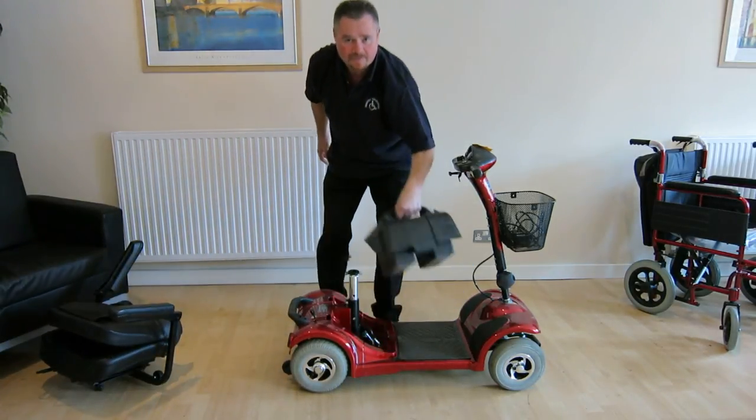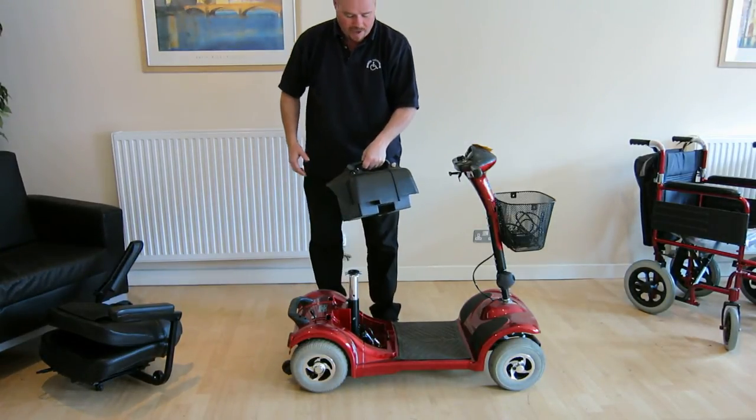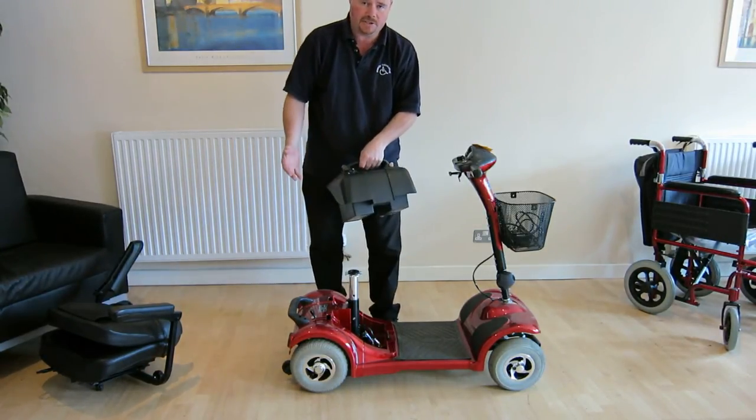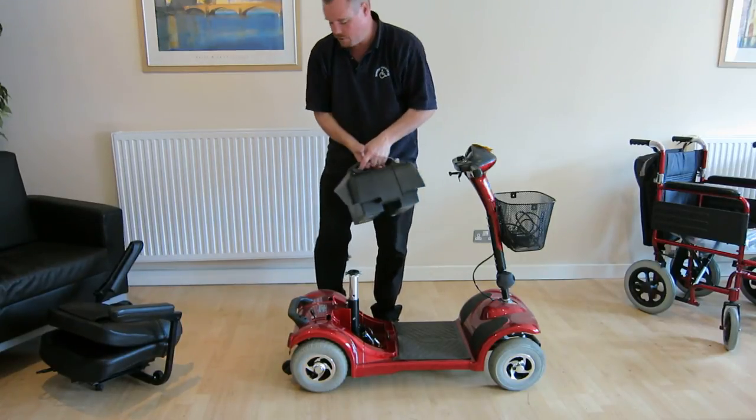The battery simply lifts off. This is where you charge the batteries, so you can choose somewhere convenient to charge them, like on a kitchen work surface or what have you. Or you can leave the batteries on the scooter and charge it in situ.